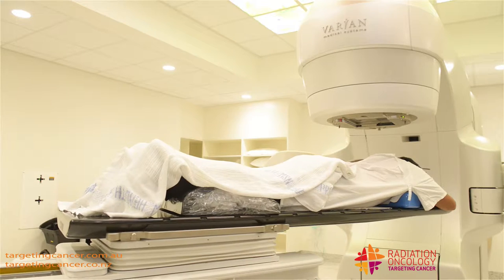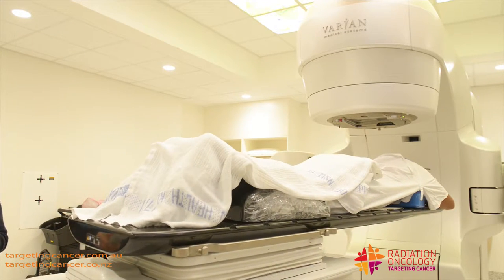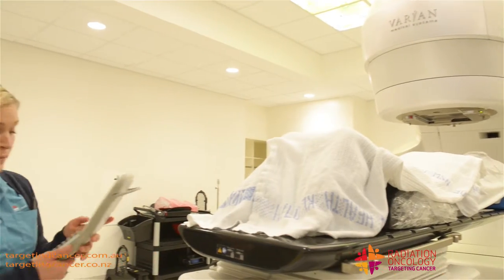This is just one set-up — a very simple spine set-up. However, the vac bags that you have behind you are used for a different kind of set-up. That's just another piece of equipment that we have to make sure the patient is stable and comfortable during their treatment.